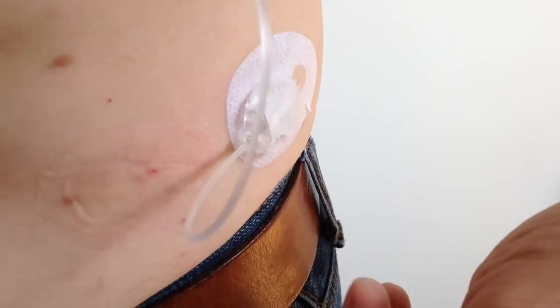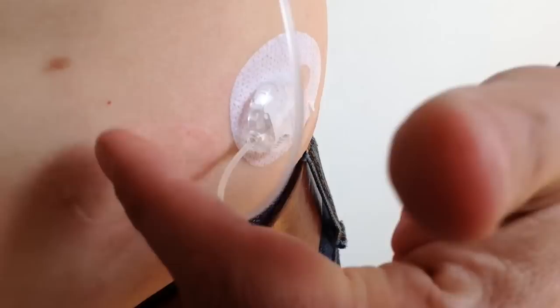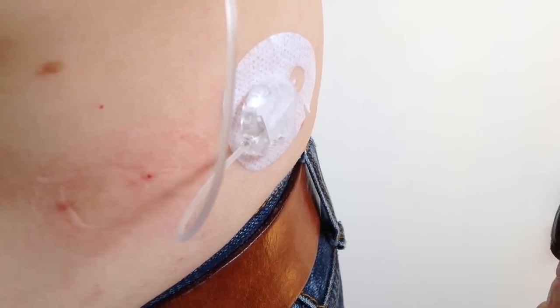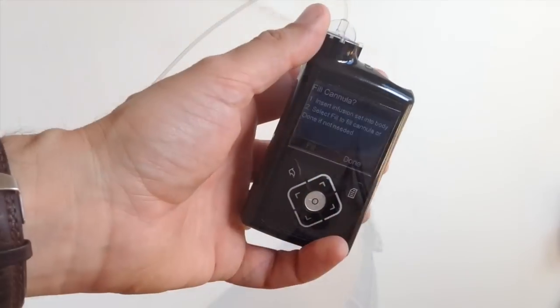You can see it's fairly, there's not a lot of discoloration there. There's just a tiny mark where the cannula actually went in. I'll put a little spot of Savlon on that. A little bit of antiseptic cream. And that'll clear up in no time at all. Now back out on the pump.